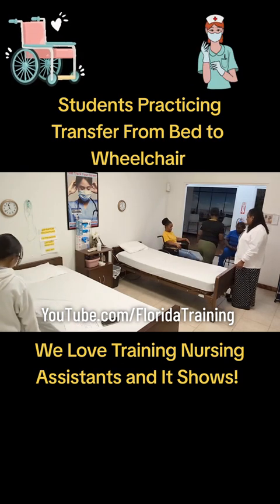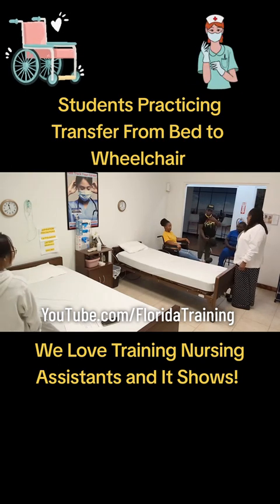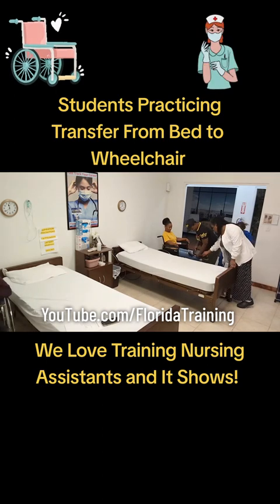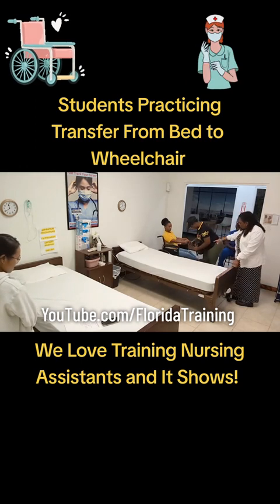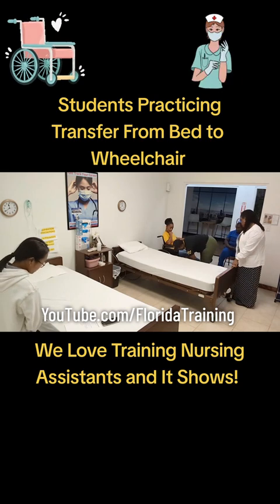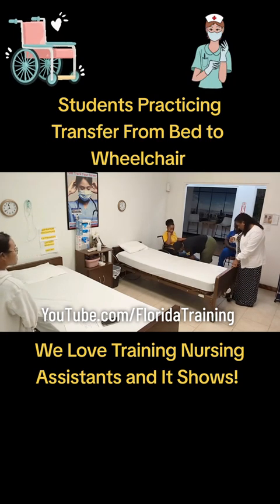Now we'll get the other leg — and she is high for real. This leg is a little bit special, let me bring it back around. For this one, you have to actually pull the metal handle back. Good. Now put the holes on top of the little. And then you can take off your belt.